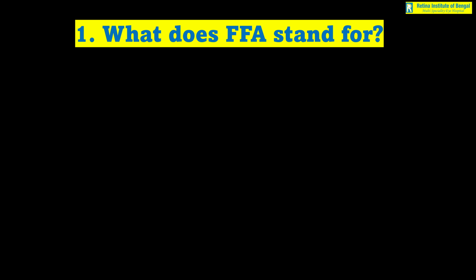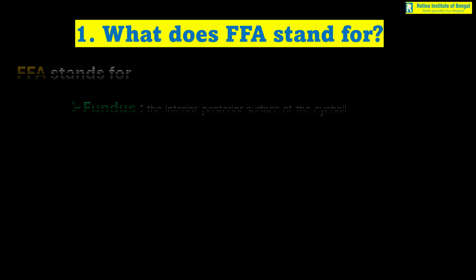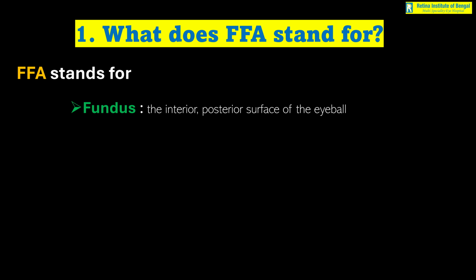So the first thing first, what does FFA stand for? So FFA basically stands for fundus. The first F is for fundus, which is the interior posterior surface of the eyeball, which includes the retina, the optic nerve, macula.